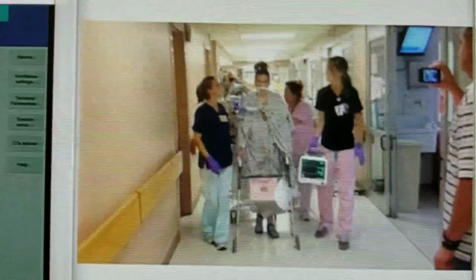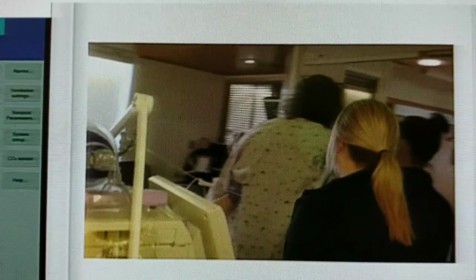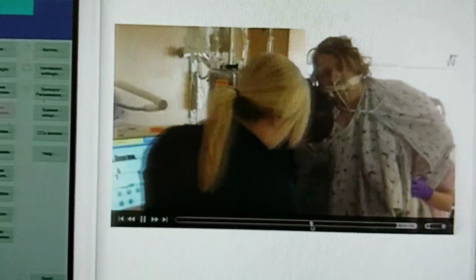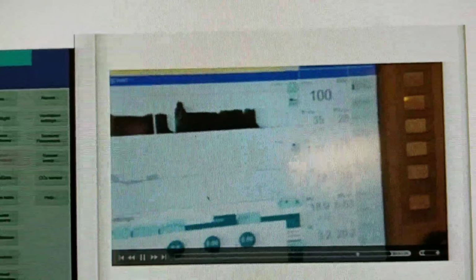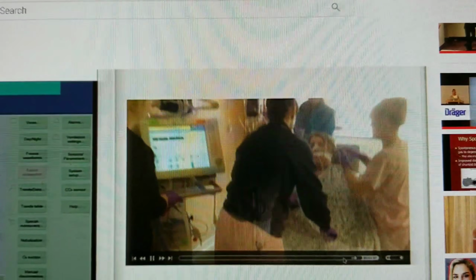Here we see at Dr. Nadir's ICU, patients on APRV that are intubated, that are walking around. These are APRV patients. So I highly doubt that this is a mode that creates a lot of work of breathing, or that you need heavy sedation because it's a reverse IE ratio.